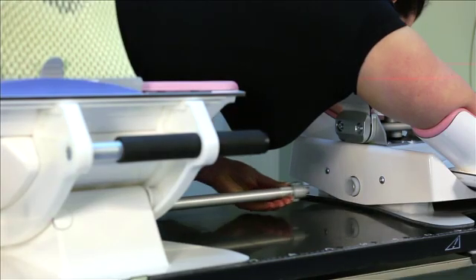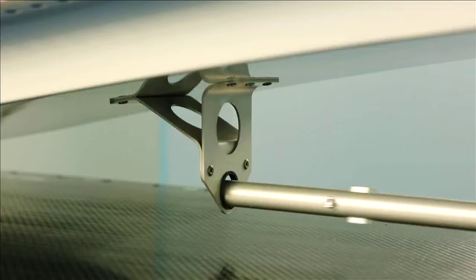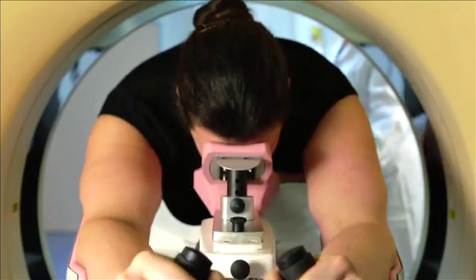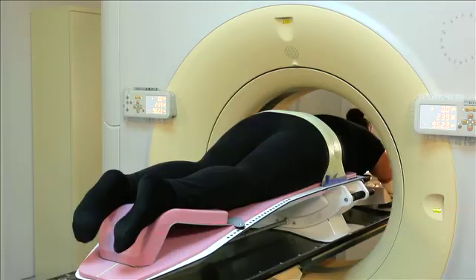Pull the metal shaft backwards to secure the position of the Sagittilt. Now you can perform the scan of the patient. Based on these images, the physician will determine if tilting the patient is necessary or not.